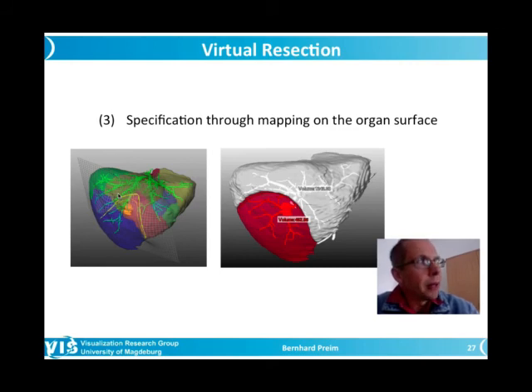Intuitively, we would expect that the influence decreases the further we are away. Yeah? When I move the point from one position to another one, defining a certain distance, a few millimeters, then adjacent points should be translated less, and even points that are even further away should be displaced even less or not at all. Yeah? So we are searching for a function that models this, and there are different alternatives that could be chosen.